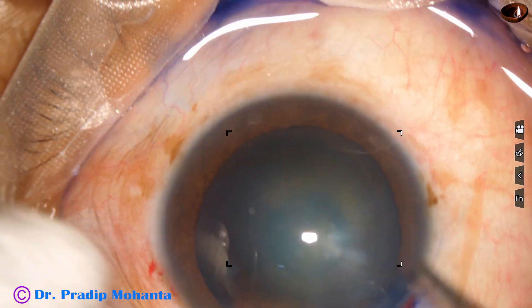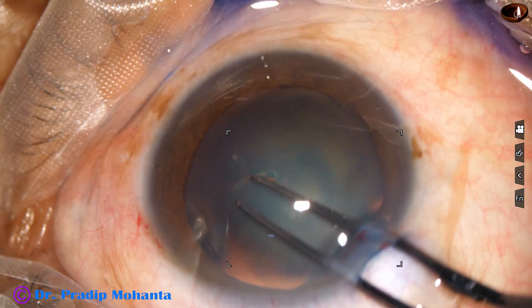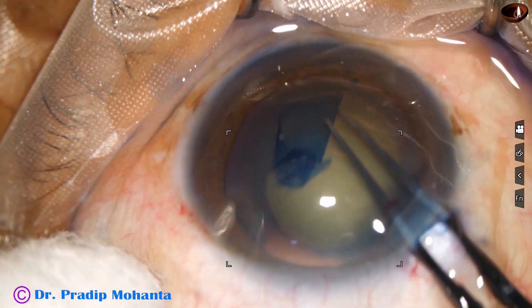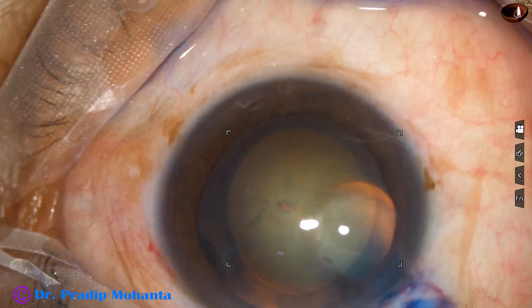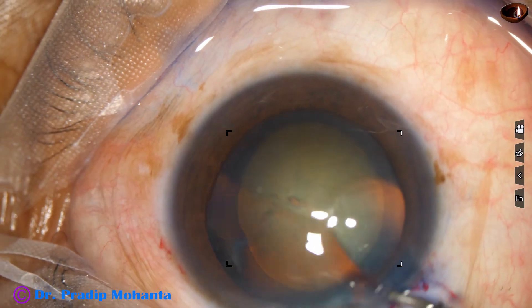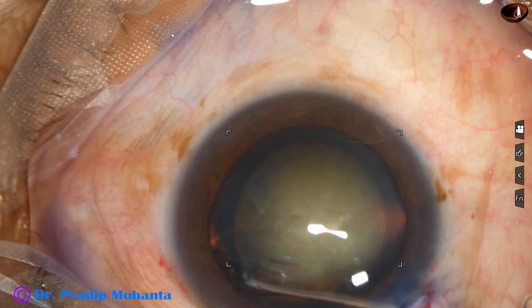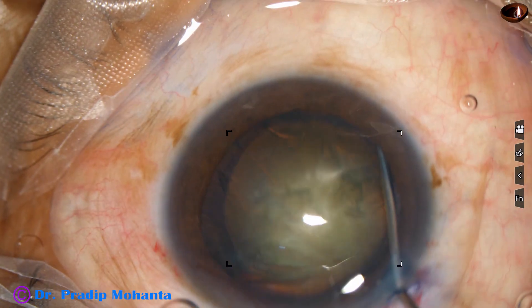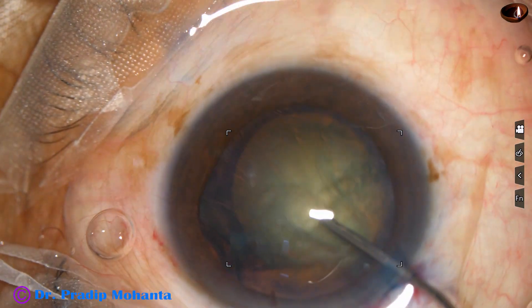Go to high magnification and do capsulorhexis. While doing the capsulorhexis I notice a black area just under the side port. And suddenly I see a red glow through this. And I get sure that there is zonular dehiscence.